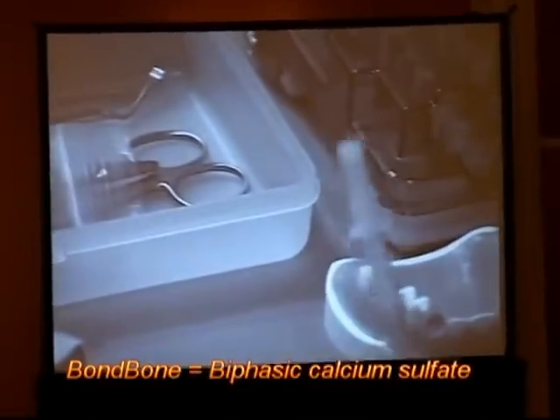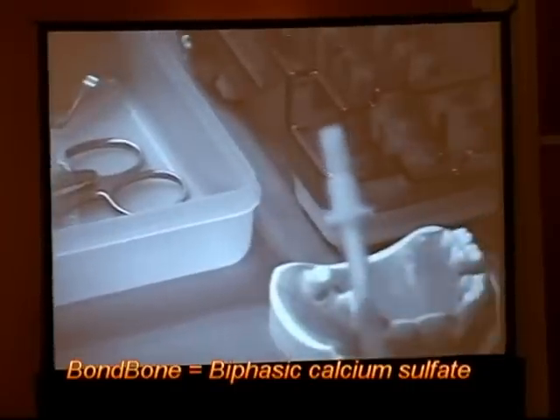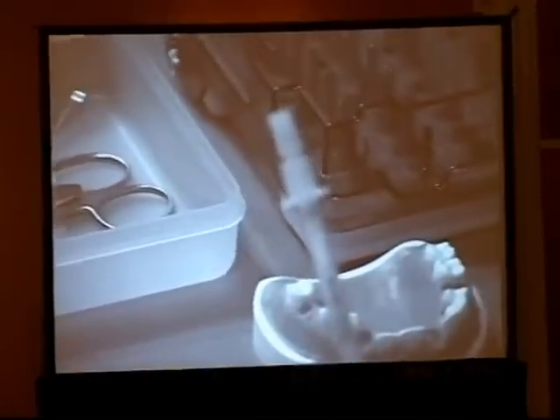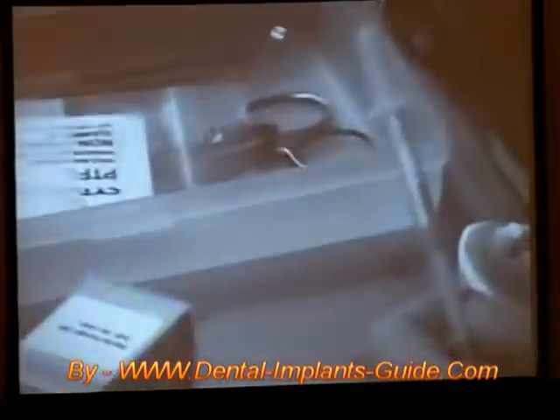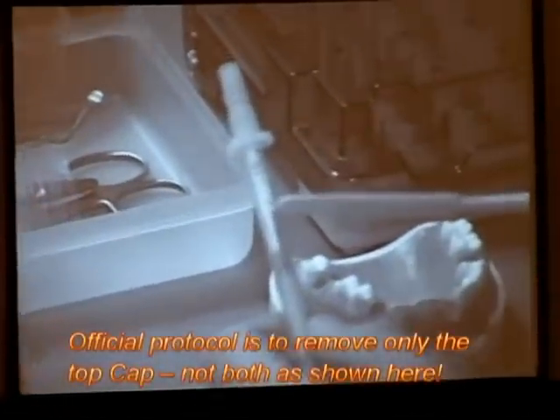What I will do is I'm going to withdraw the plunger about one centimeter. Now you can see that there's air space between the plunger and the calcium sulfate.